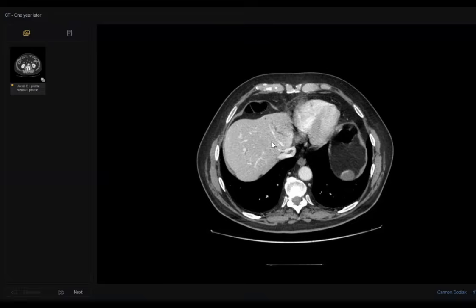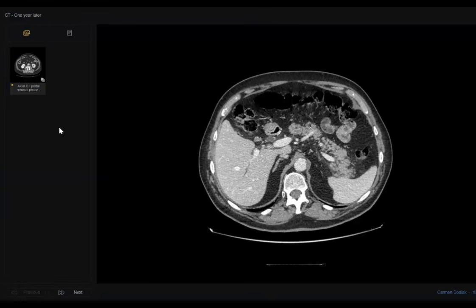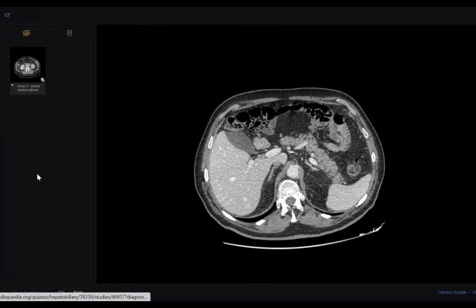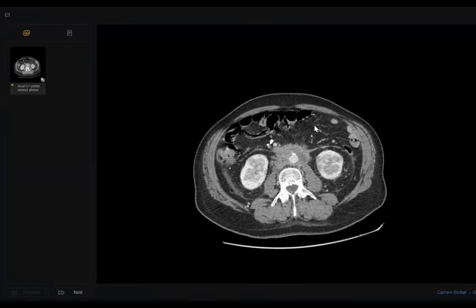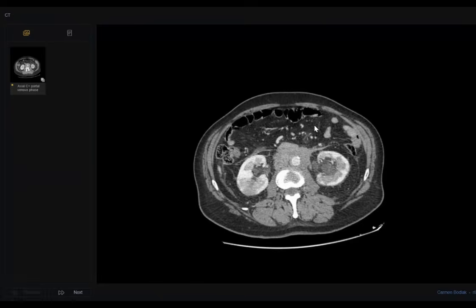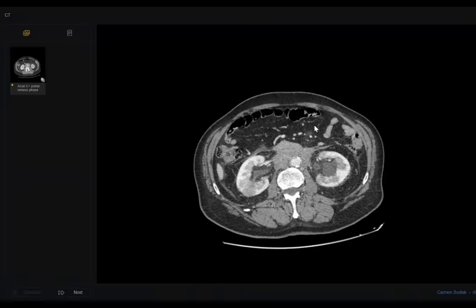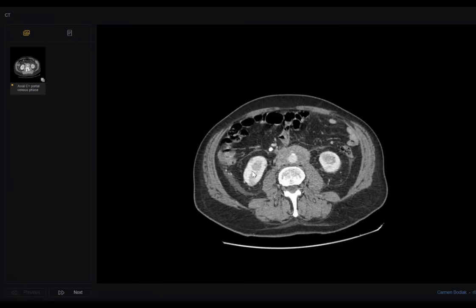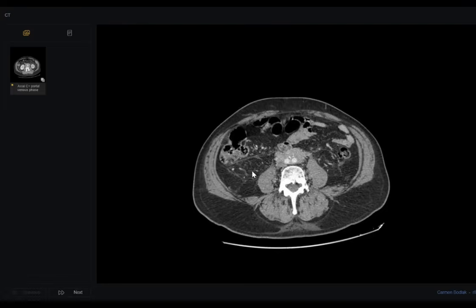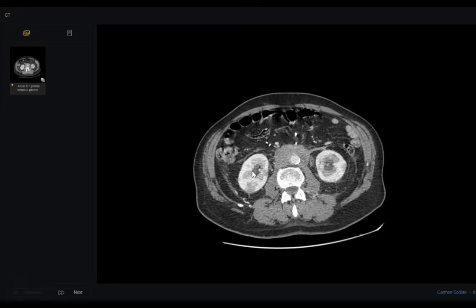To summarize the case, this patient has IgG4-related disease with a history of retroperitoneal fibrosis and newly developed sclerosing cholangitis. I would refer the patient to the clinical team for management of the retroperitoneal fibrosis. If the clinician insists on getting a biopsy from this lesion, could you describe the technique? Technique means from which side and which direction you will insert the needle.